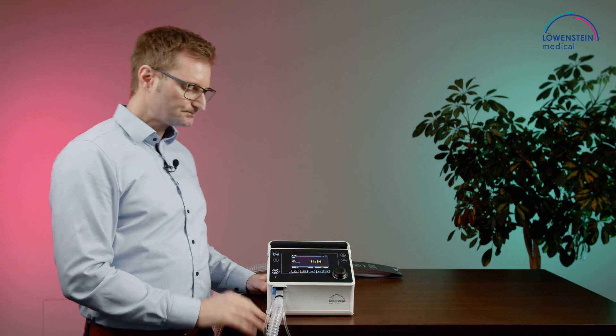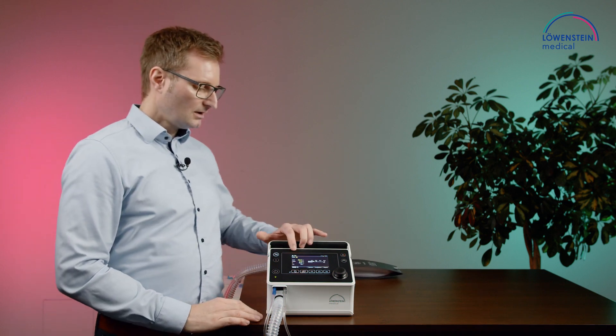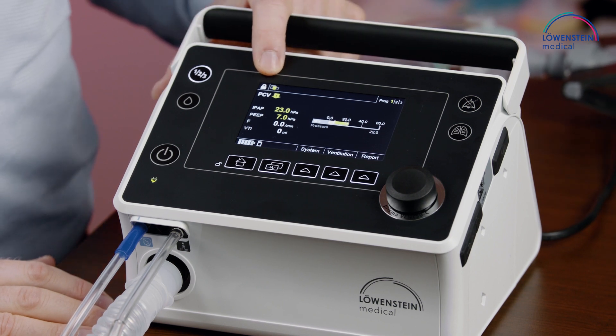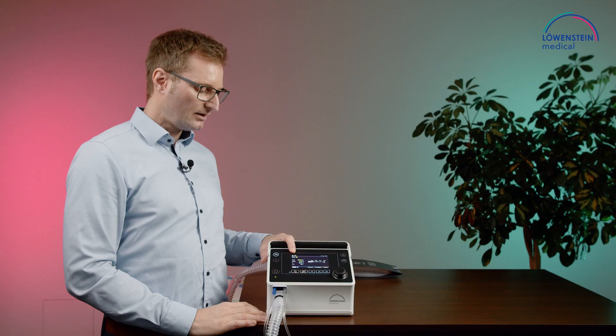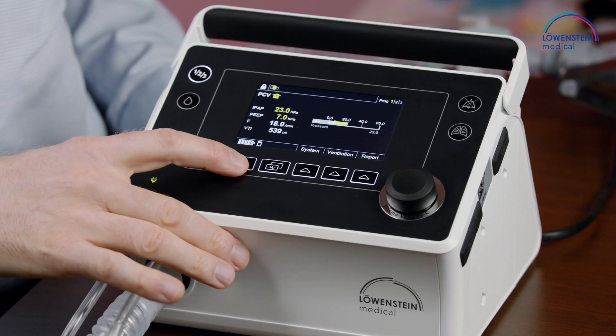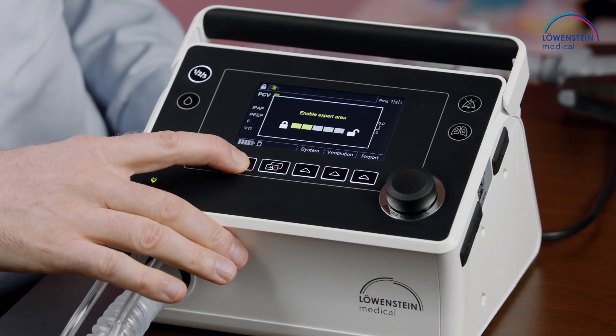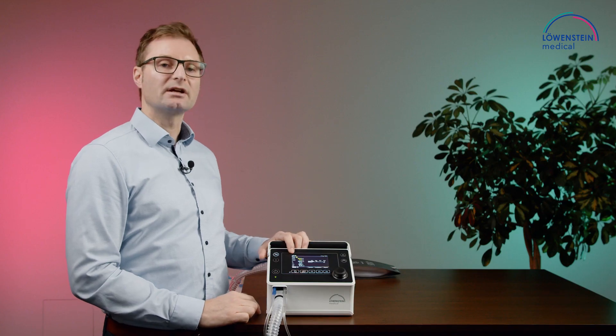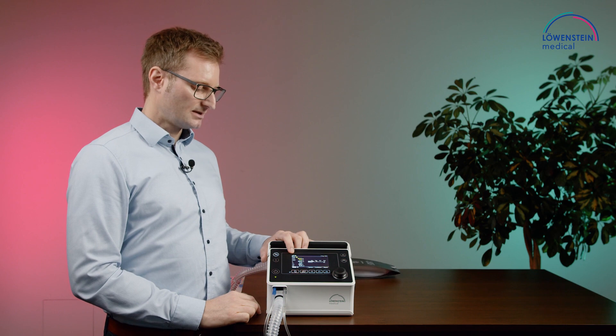Let's have a look at the display. On top of the display we see the lock symbol — the device is now locked, so you can't set anything. To unlock the device, you need to press the home button for three seconds. Now the device is unlocked and you can do all necessary settings.